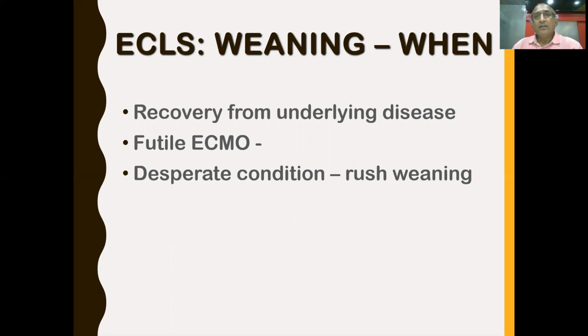So what are the criteria, or when should we think of weaning the patient from ECMO? First, when the patient starts recovering from underlying disease. Second, when you feel that ECMO is futile, when you don't expect the recovery to take place. And third, there are situations where patients do respond partly, but there is some condition where continuing ECMO is going to be more harmful. In that case, you think of weaning the patient from ECMO as early as possible.